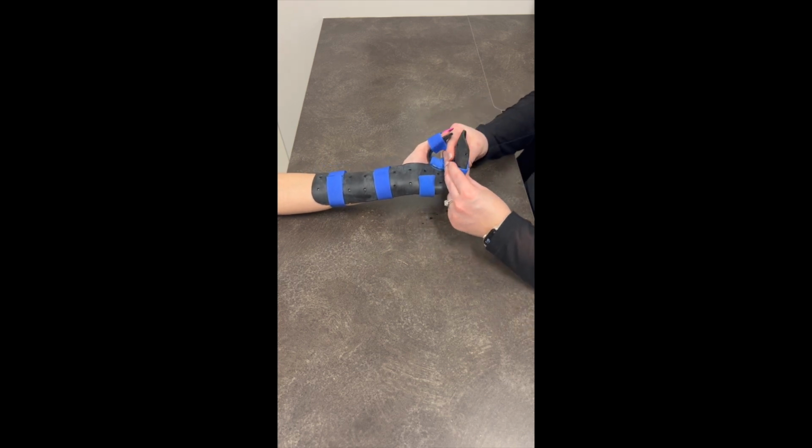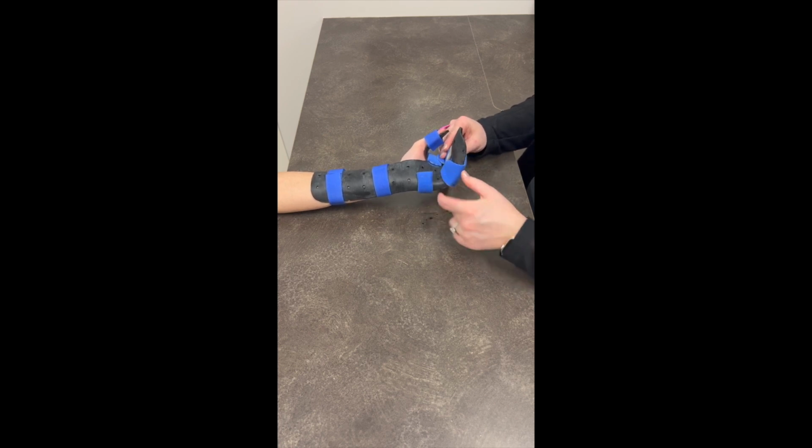For the strap around the fingers, you are welcome to split it into 2 straps. For this orthosis, we went ahead and did one thicker strap.